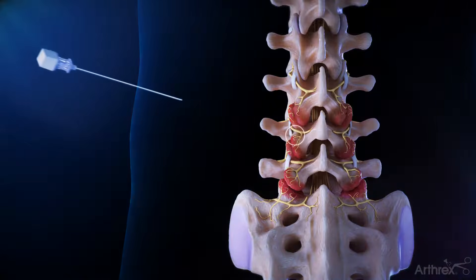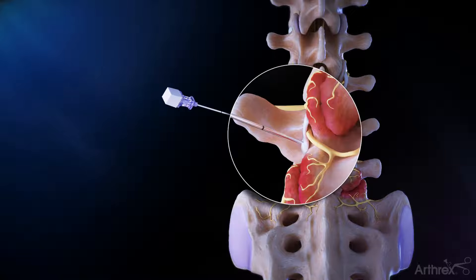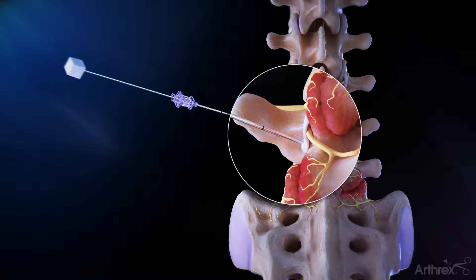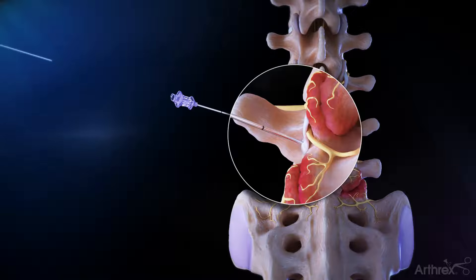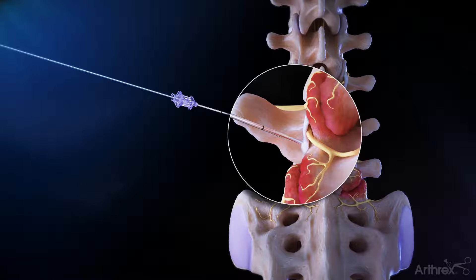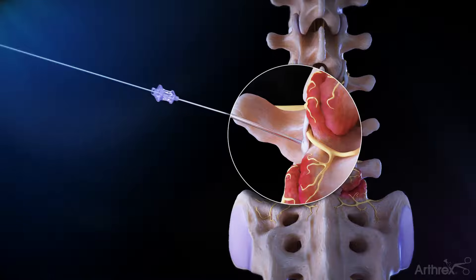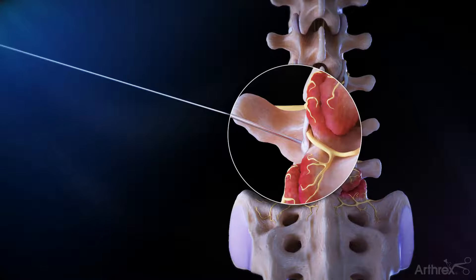Through this incision, a cannula is placed to prepare for the spine endoscope. The endoscope provides real-time direct visualization of the surgical site to allow for increased precision during your procedure.